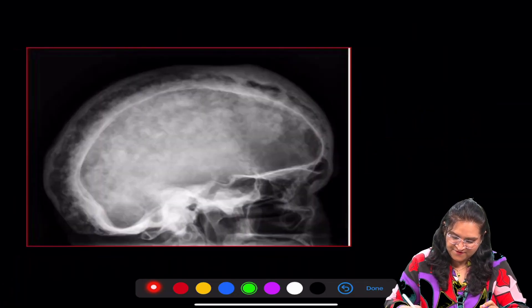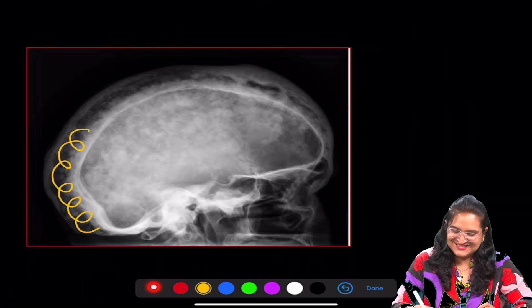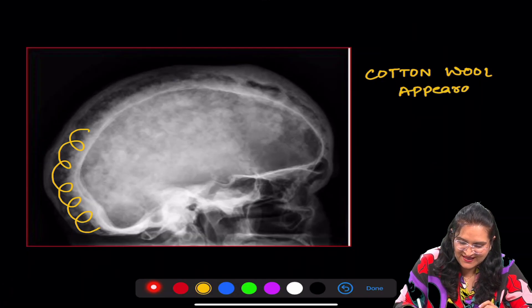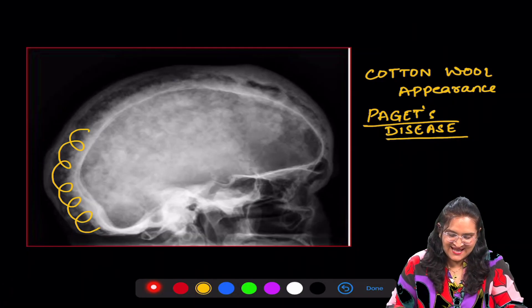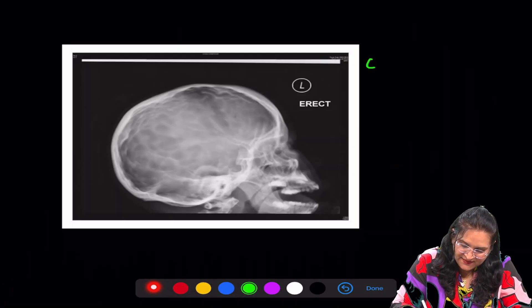Next radiograph — doesn't this look like cotton? Yes, this is cotton wool appearance and this we see in Paget's disease. Cotton wool appearance: Paget's disease.